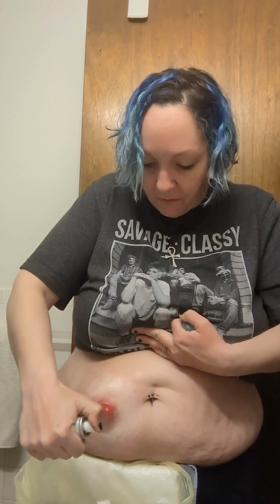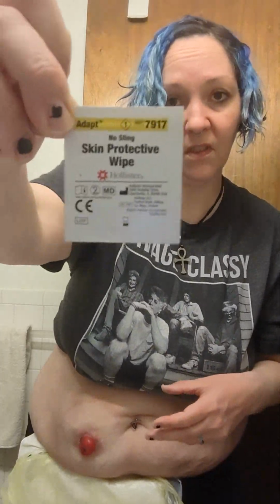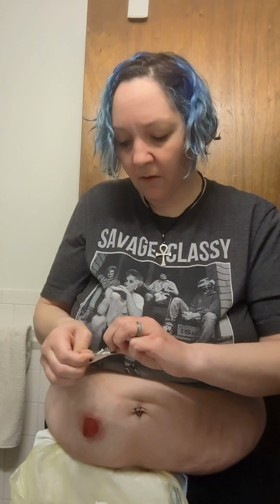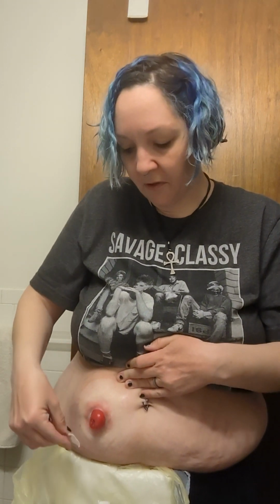Yes, girl, work. Okay, because there's powder, I use the spray. Not my favorite. It doesn't have the best adhesion power. So I prefer the No Sting Skin Protective Wipes from Hollister. They are like freaking glue.